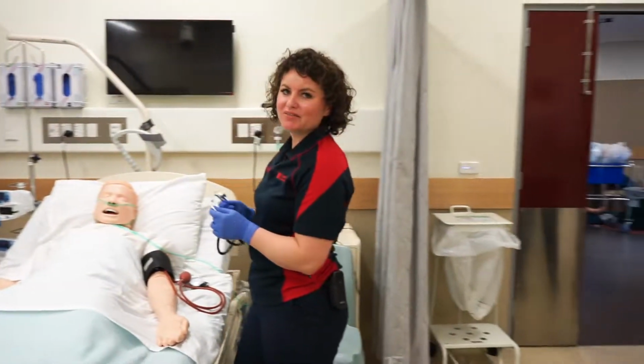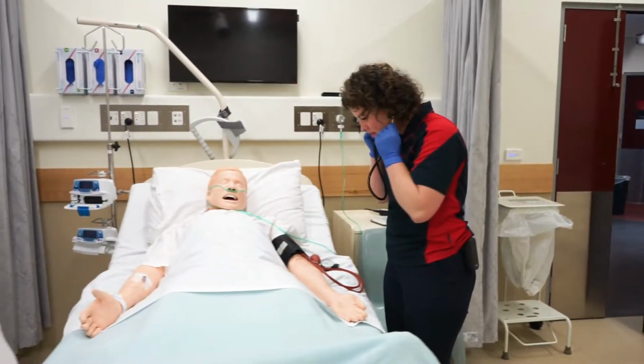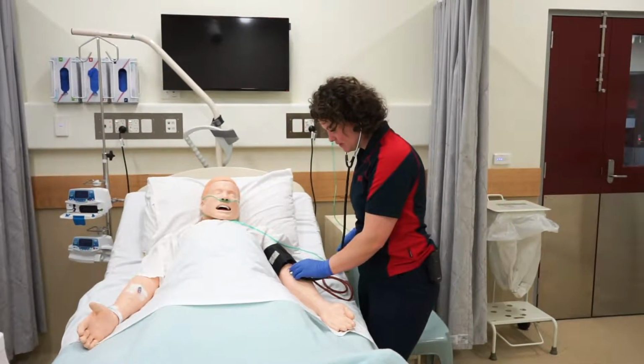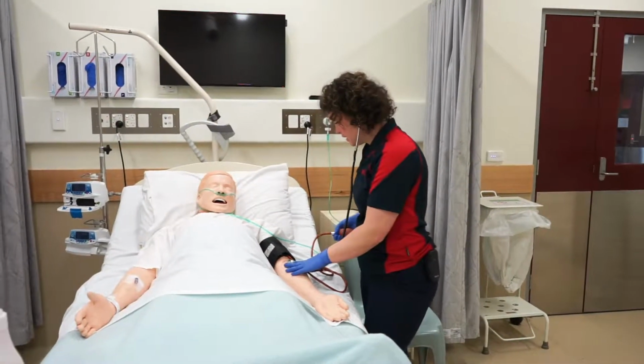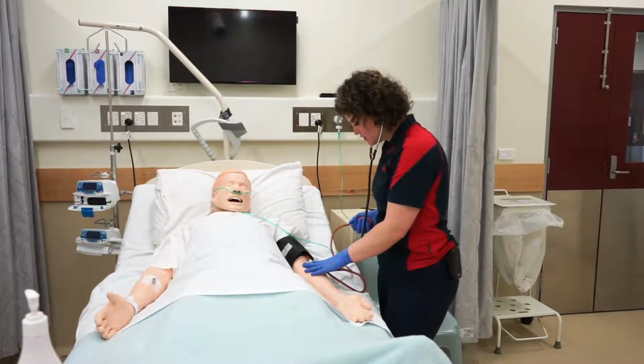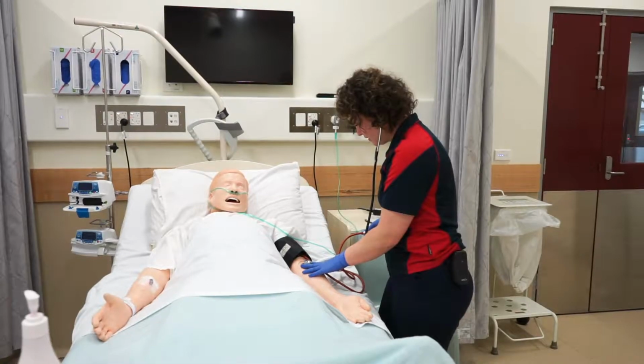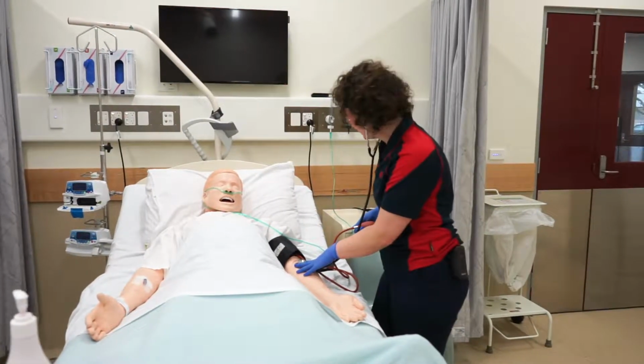I'm studying Bachelor of Nursing at CSU. Second year, second session. What are you doing right now? I've got a patient here with pneumonia and sepsis, so I'm just going to do a blood pressure on him. So when you say patient, do you mean the mannequin? I sure do. So what are they about?